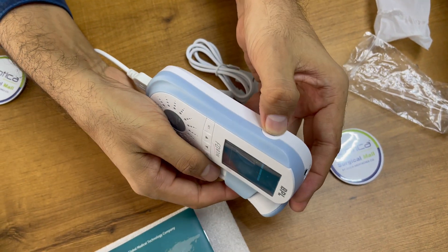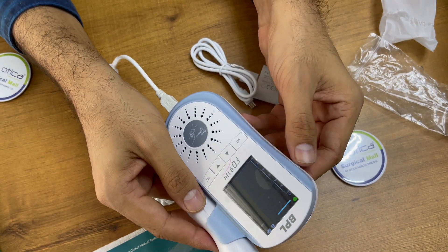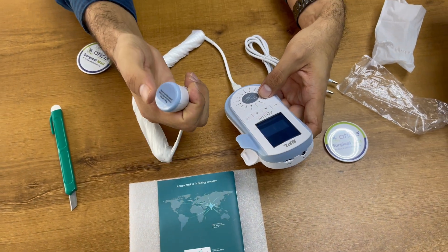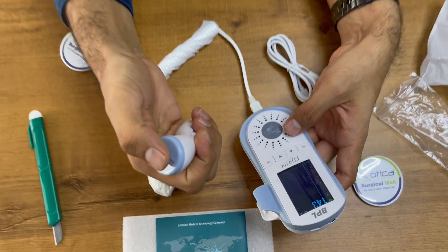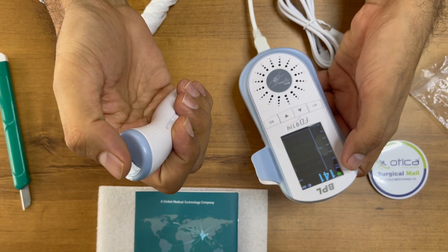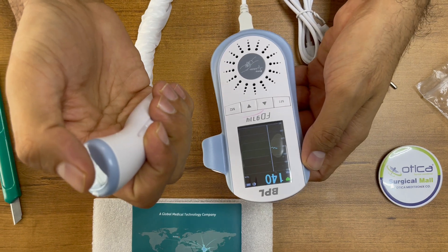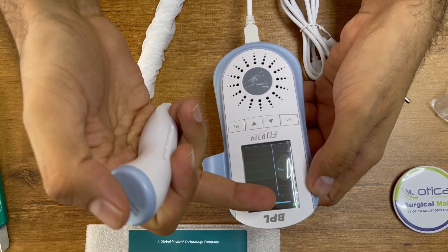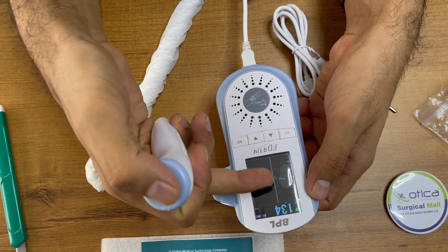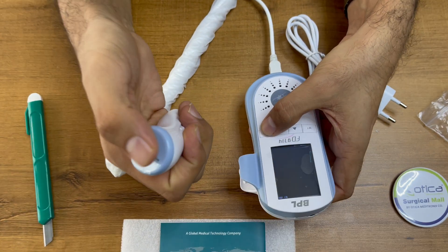This is the main power button, on and off. You just need to place the probe here — we are just tapping to demonstrate. On the top of the screen it will give you the pulse rate, and here you can see the FHR curve. You can increase and decrease the volume using this button.